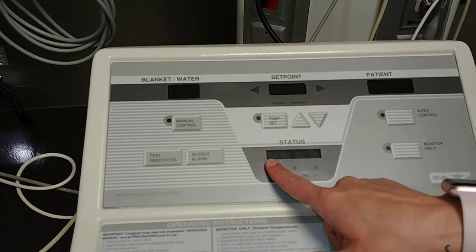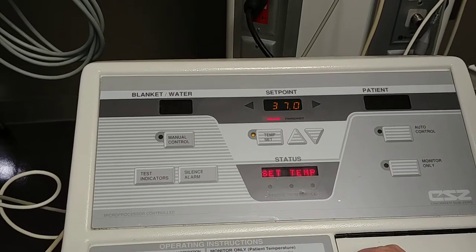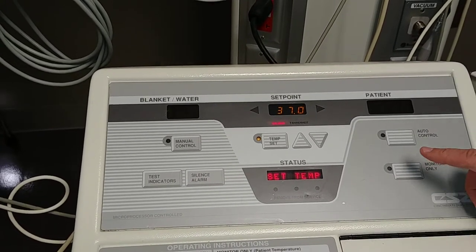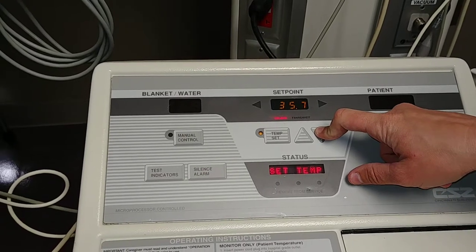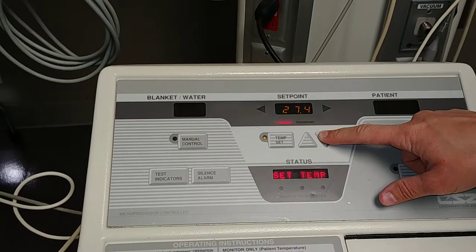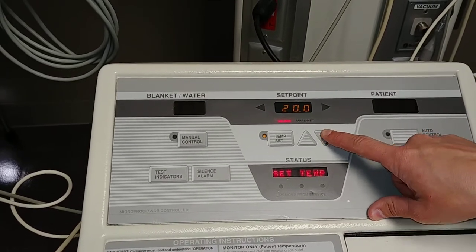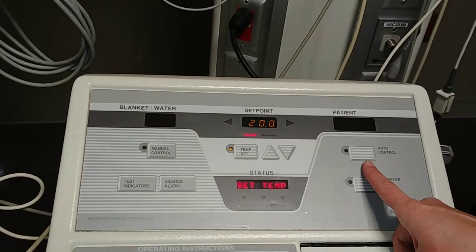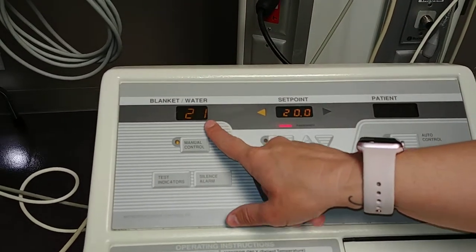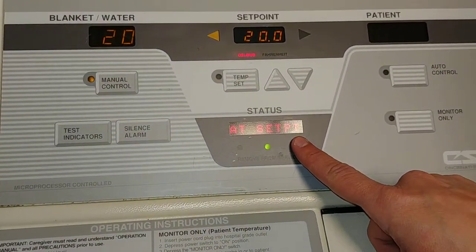When you turn it on, you're going to see the status as 'check set point.' Depending on what you want your patient's temperature to be, hit 'Temp Set.' We want to cool the patient, so I would suggest doing 18 to 20 degrees — we'll do 20. There are two modes on the cooling blanket: manual and auto. We are currently only doing manual control. Once you've set the temp, hit manual control. You'll see the current temperature of the water, which is 20, and the status will show 'at set point.'